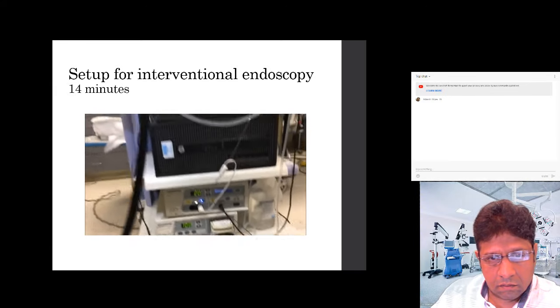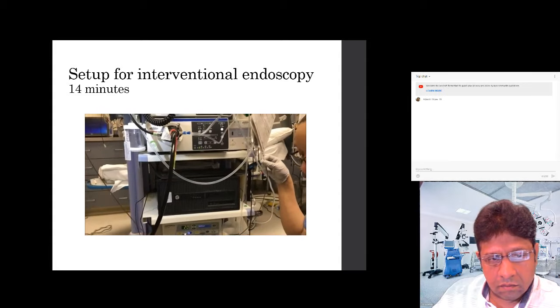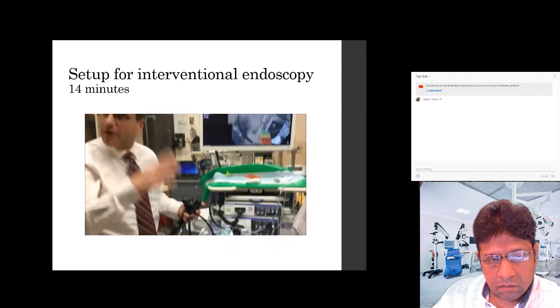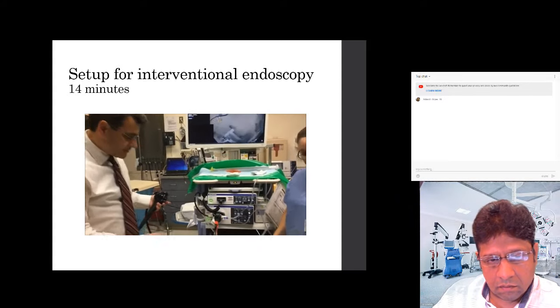This can be connected to the water, but most of the time we don't do it because the doctor can do it from the scope. It's more of an older tool. The water used to go through here, but now we have the water going through the scope. So if we want to wash the blood away, we already have it hooked up through here. So really, that's how you hook that up.